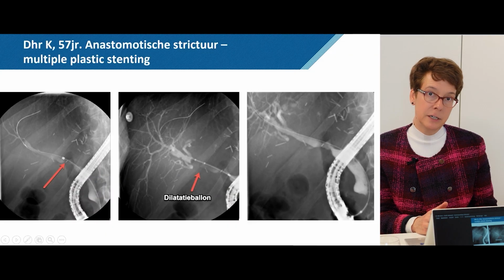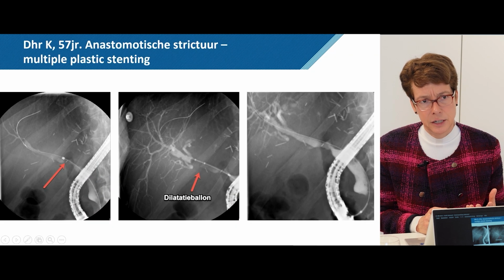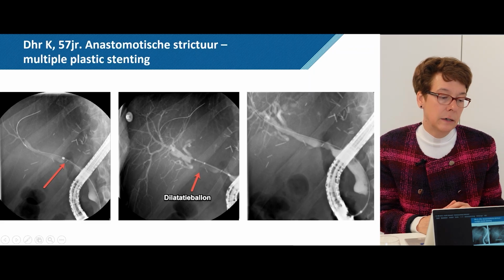So that's the early phase. It's ischemia, that cast, and the main challenge is, A, you don't see the cast so well. I think that was nicely shown in that video. And B, the aim would be total clearance, if possible. Yeah. So then, second period, stricturing. So then you get the stricturing, and then you have all kind of different kind of strictures, actually, as we just briefly highlighted before. I think the most common stricture you see is at the anastomosis. So that's where I would first have the close look. I think you can see it here on this image.